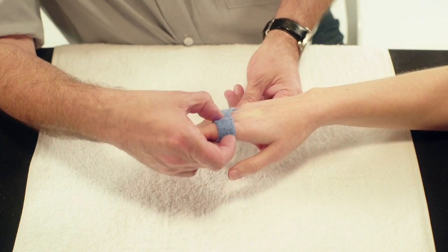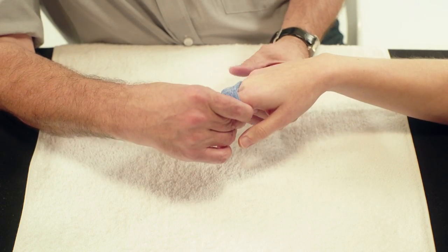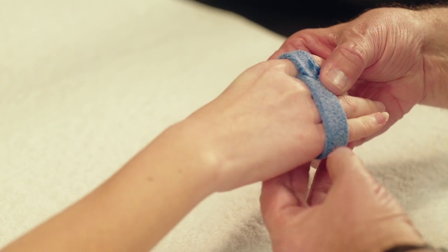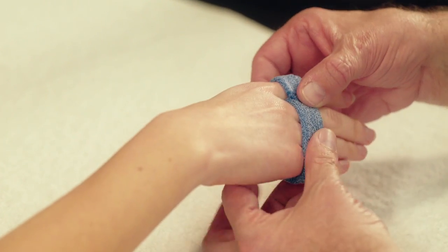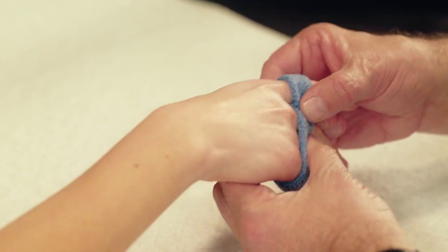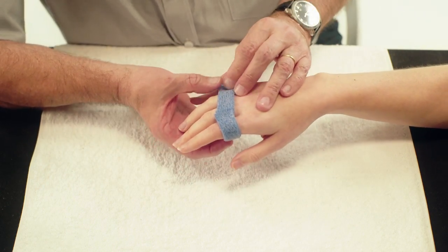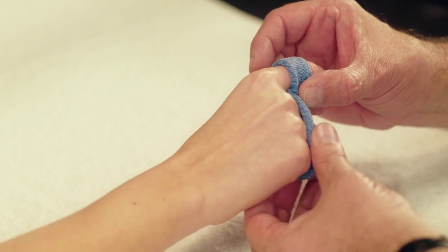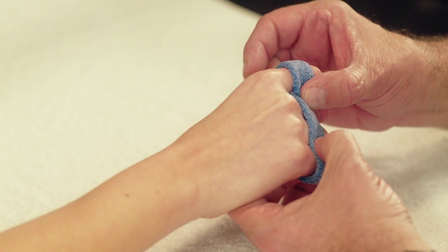Wrap the orthicast around the first phalanx of the index finger. Pass the material over the dorsal part of the first phalanges of the other fingers. Wrap the end of the orthosis towards the palmar part of the first phalanx of the fifth finger.